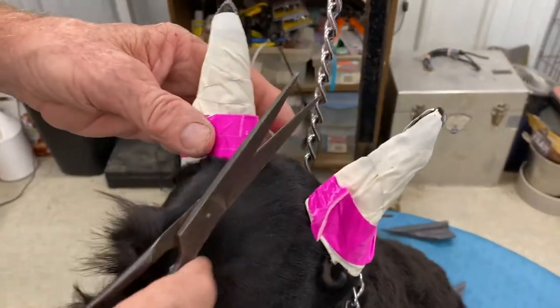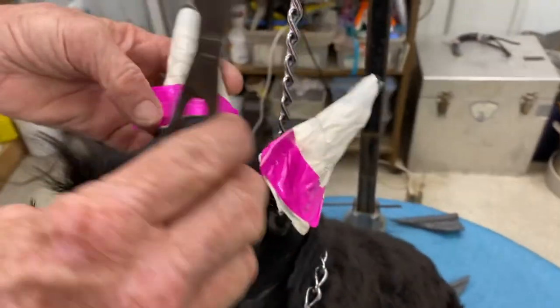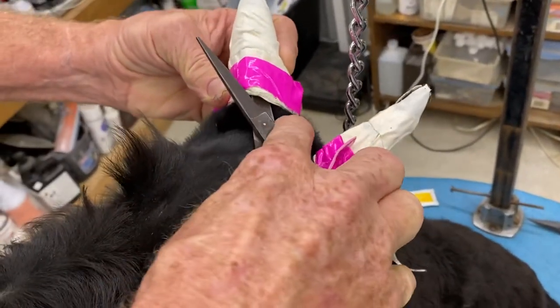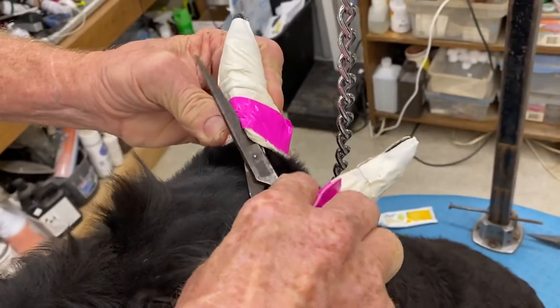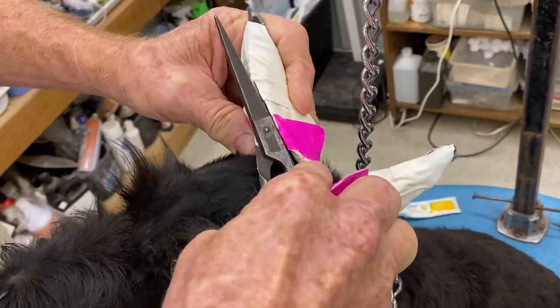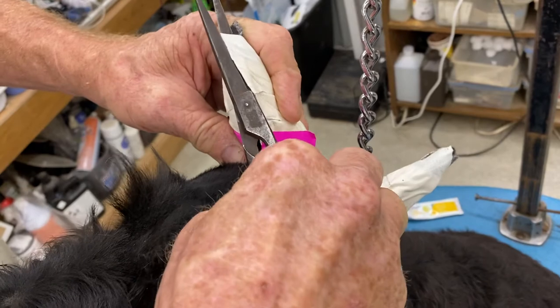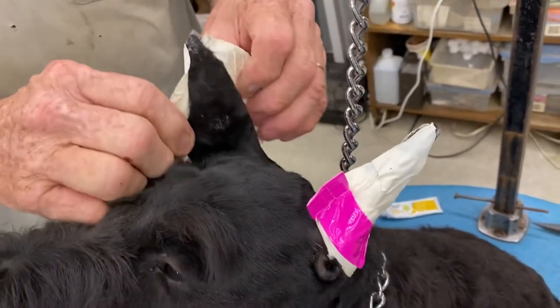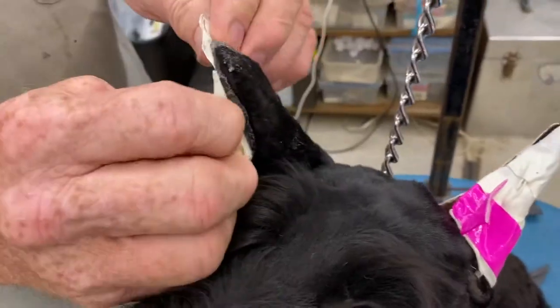Cut the tape in the middle. Take your scissors, lay them flat, run underneath the tape, make sure you do not angle into the ear, and pull the tape off like this.